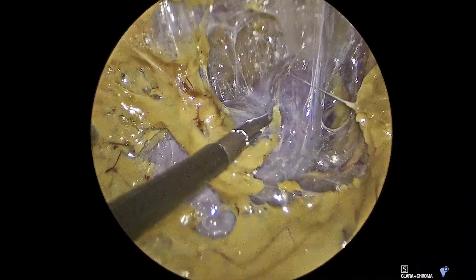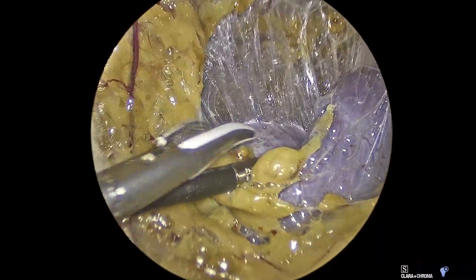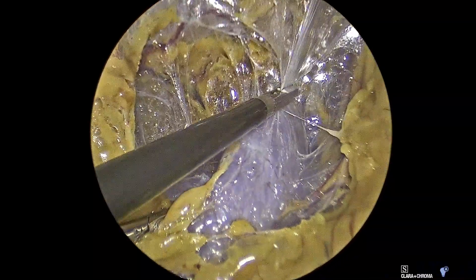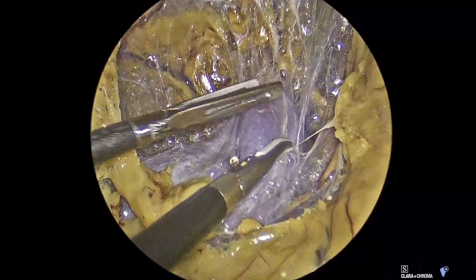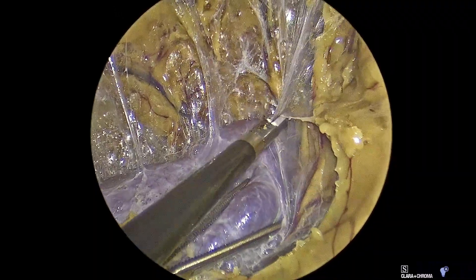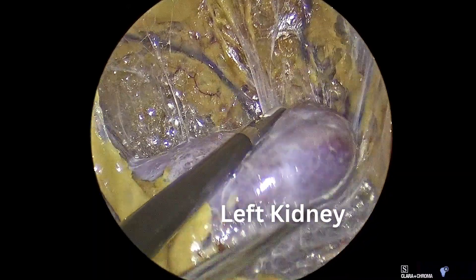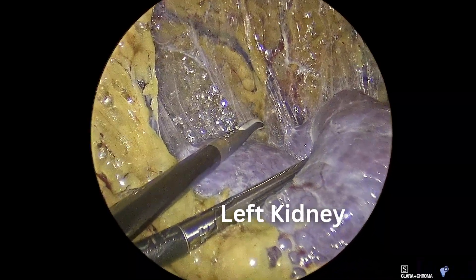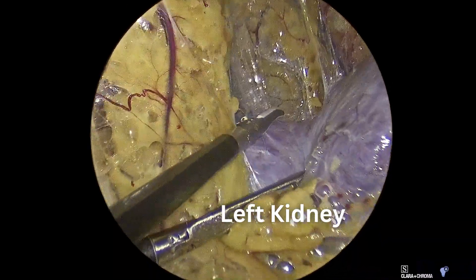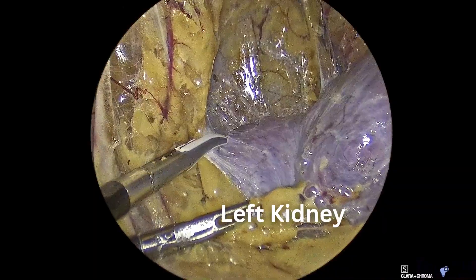A 12 millimeter incision has been made just below the tip of the 12th rib, and then blunt dissection creates the retroperitoneal working space. Two additional 5 millimeter ports are placed under direct visualization, forming a triangular configuration for the endoscope and instruments — a grasper and a ligature device which uses thermal energy to coagulate the vessels. A 5 millimeter endoscope is used and carbon dioxide insufflation maintains a pressure of 28 millimeters of mercury to expand the retroperitoneal space. I identified key landmarks including the paraspinous muscle and the left kidney.